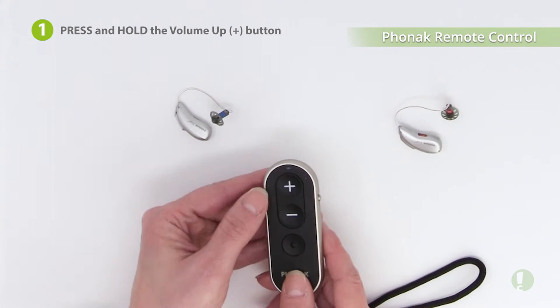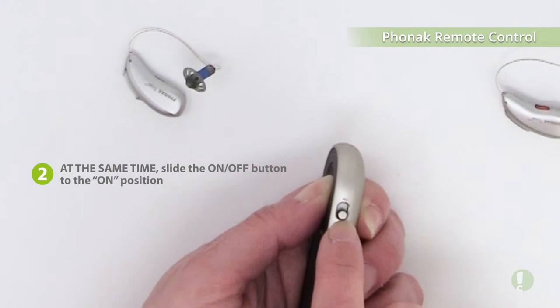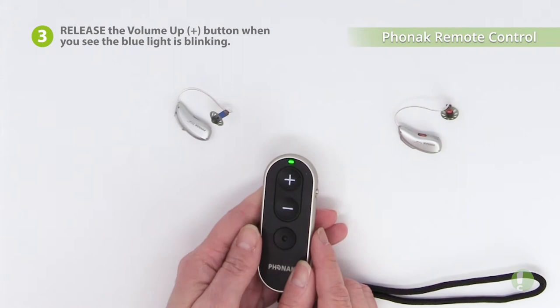You first press and hold the volume up button — this plus sign here. At the same time, you switch on the remote control by sliding this button here. Release the button once you see the blue light blinking.